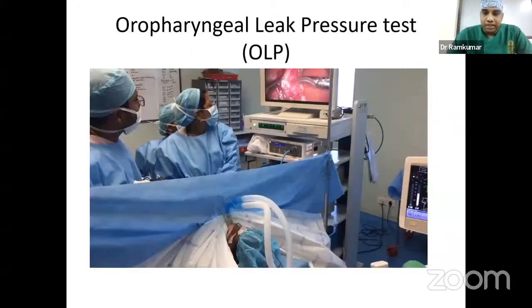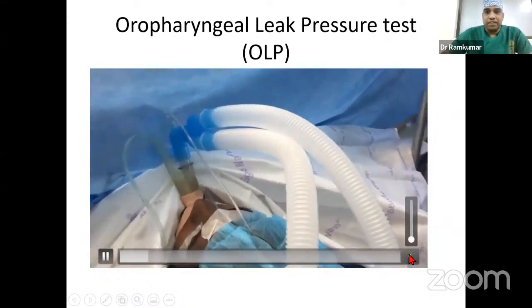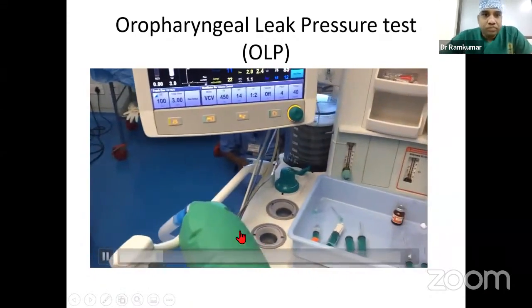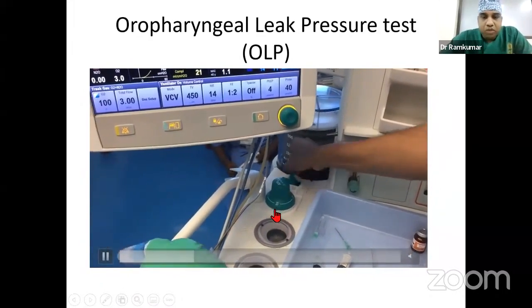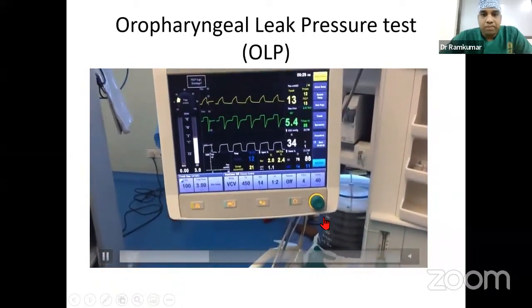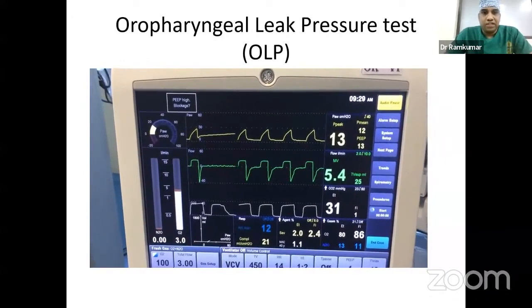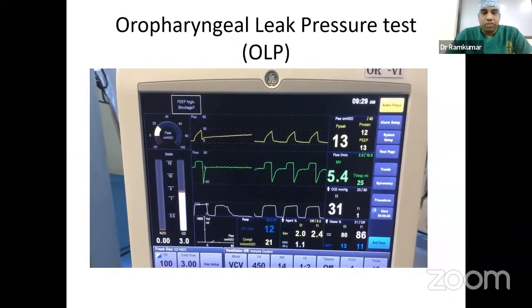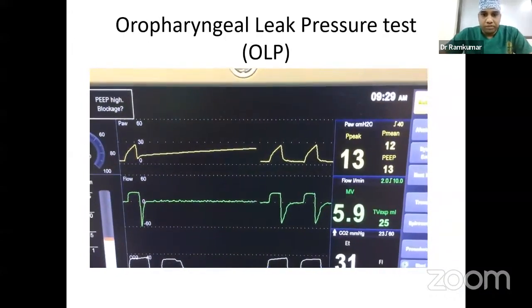How is it tested? This is how it's done. I'm showing an assessment of oropharyngeal leak pressure in the middle of a laparoscopic surgery, because if it's going to leak in the middle of a surgery, then it's going to be difficult to manage the patient. Here I'm using a ProSeal. 3 liters of flow is kept. I'm closing the APL valve to 30 centimeters of water, and I'm going for an apneic period, that is, manual ventilation, leaving the system like that. As the 3 liters of gas flows, there's going to be a rise in airway pressure, which is going to have an upslope here.